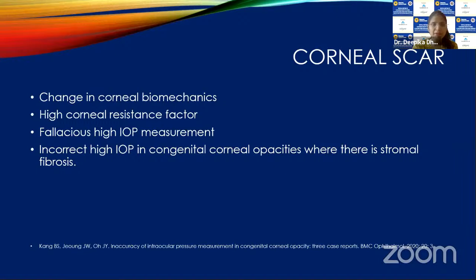Corneal scar. In corneal scar, the cornea becomes very rigid. At the site of scar, the cornea is very rigid, so it doesn't get applanated, and incorrect high IOP can be measured by Goldmann applanation tonometer and other tonometers as well.